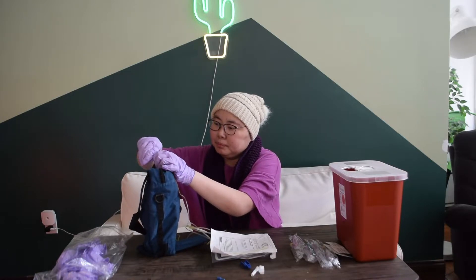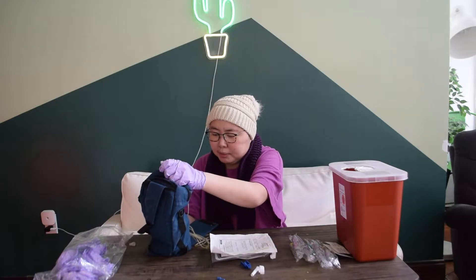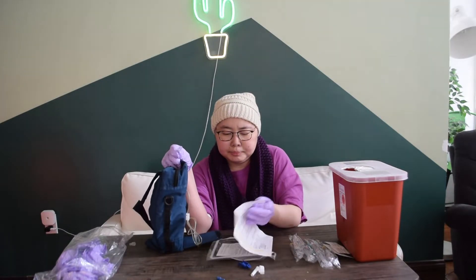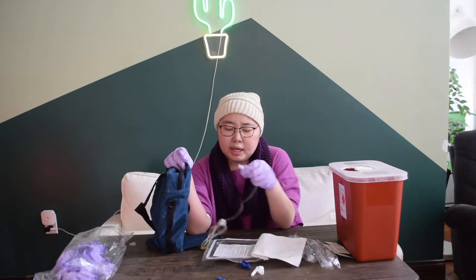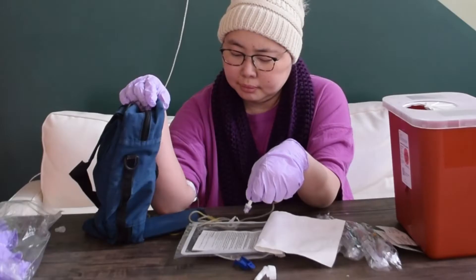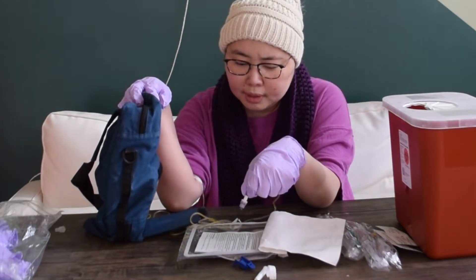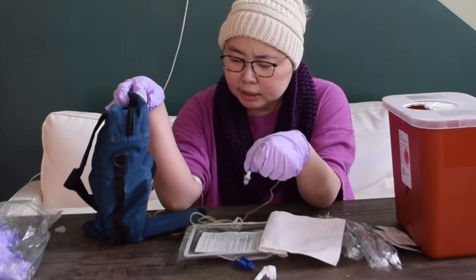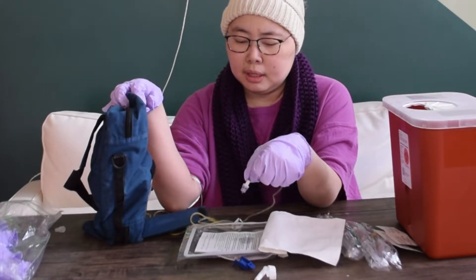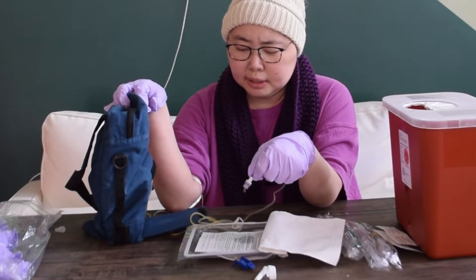I take the cap off. On the screen it asks me if I want to prime — it's a nice little pump. It tells you to make sure you're not connected to the patient, and then it starts going. For the sake of this video I'm just going to let it pour out into this bag, and then put this bag into the biohazard box. There are lots of little bubbles going through. I just got this new tubing which is a lot shorter and smaller, so priming goes really quickly. It puts the magnesium all throughout the tubing.